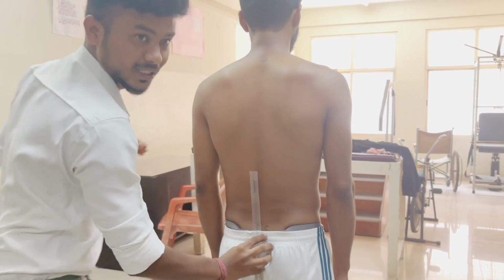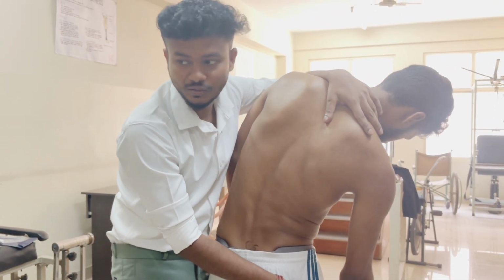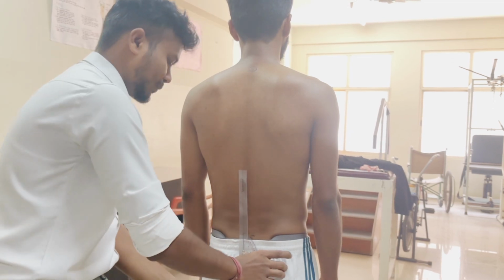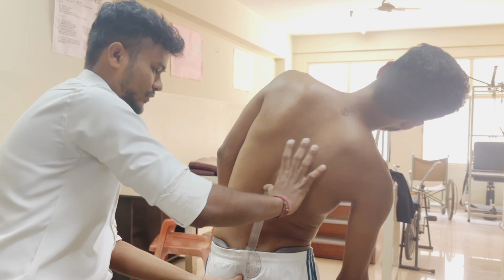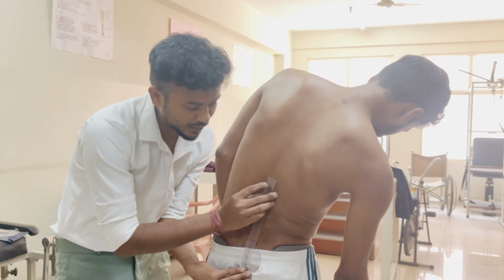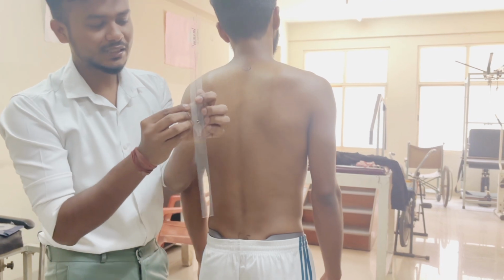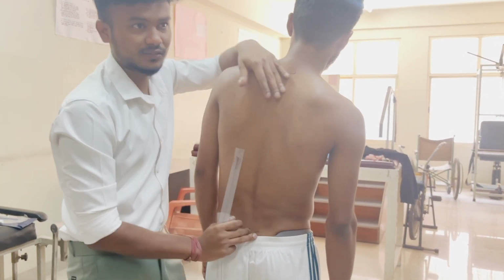Before doing this, first we will ask the patient to do one side lateral flexion, so that whenever you ask while measuring, he will do it easily. So here we are going to keep it. Then we'll ask the patient to go for side flexion. See, the spinous processes are there. We are going to place it just lateral to the spinous processes. Then relax, and here we will measure the distance, how much it comes. That is his lateral flexion.